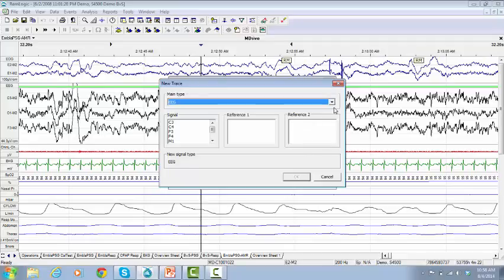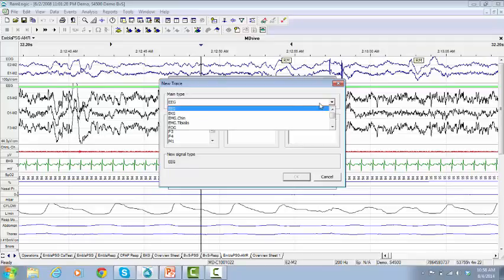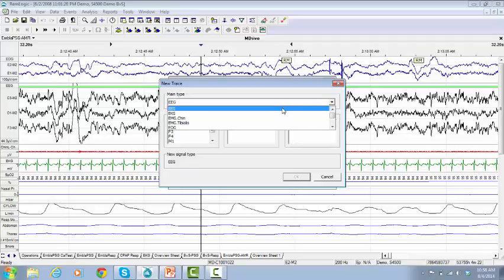Select the main type. For example, I will add the trace for EEG with double reference to reduce the EEG artifacts. Drop down through the main type and select the EEG type. From the drop-down lists, select the required exploring signal.